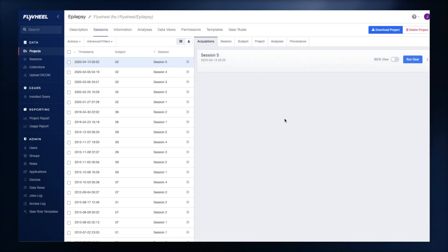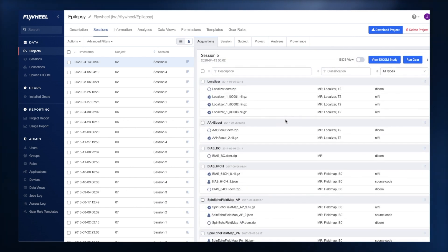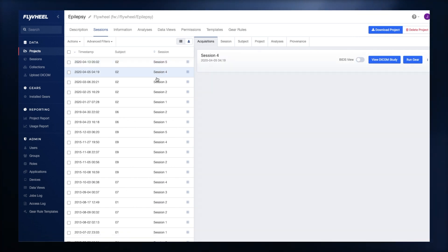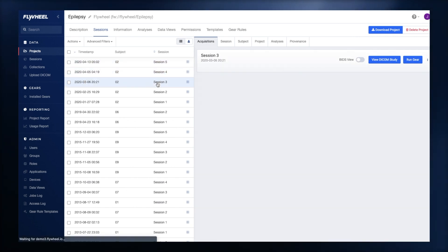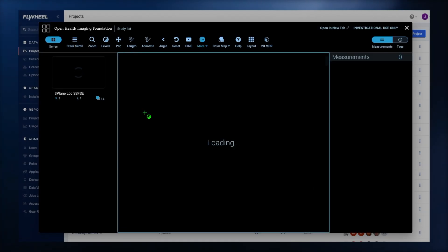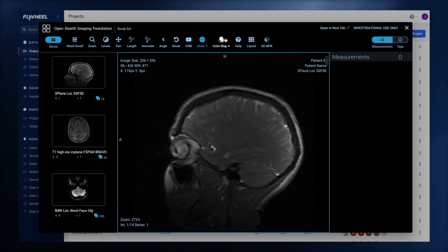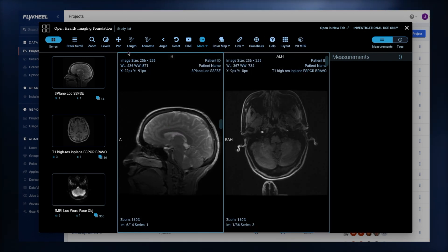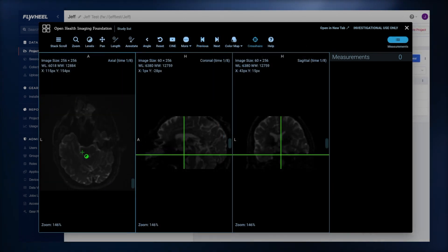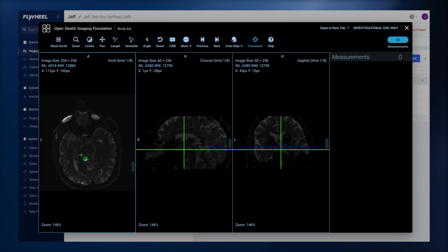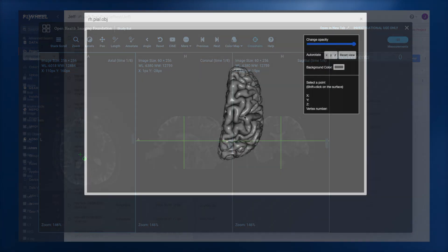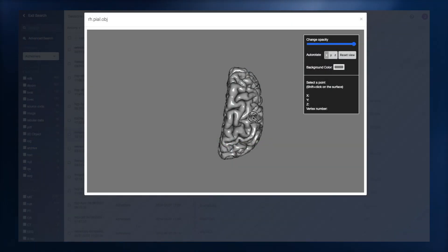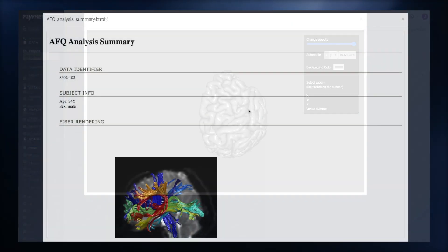Flywheel organizes your data in a convenient, easy-to-navigate research project structure. Our easy-to-use interface with support from multiple types of viewers allows you to quickly view images, analyses, and other data across your projects.